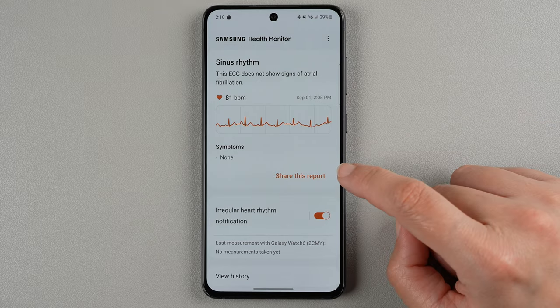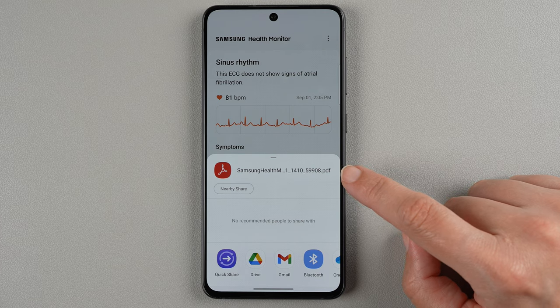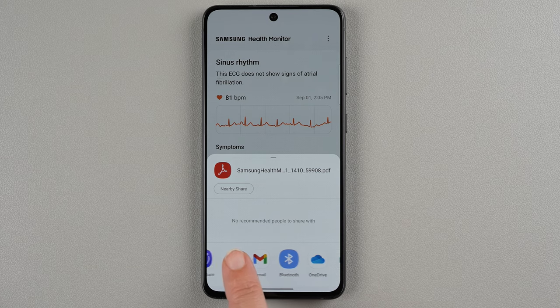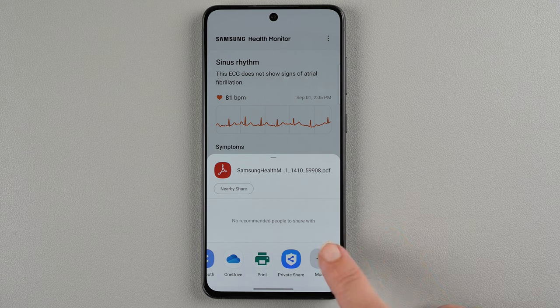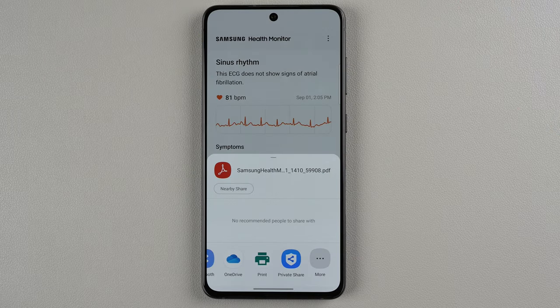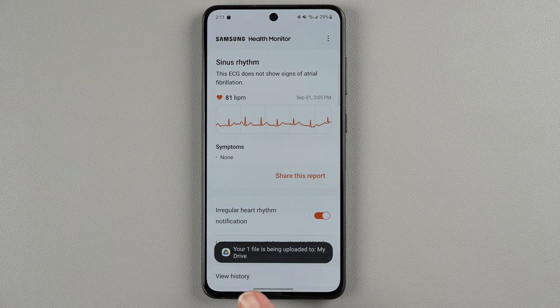I'll go ahead and tap share this report to see what options we get. It looks like we have a PDF and you have some options: you can save to your Google Drive or Gmail, use Quick Share, Print, Private Share, and there's also a nearby share option. If I were to save it to Google Drive and save again — it says my file is being uploaded to my drive.